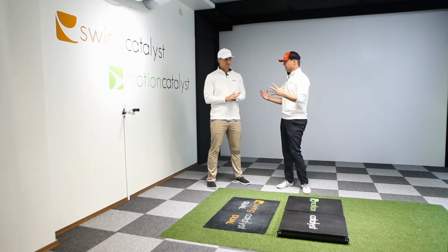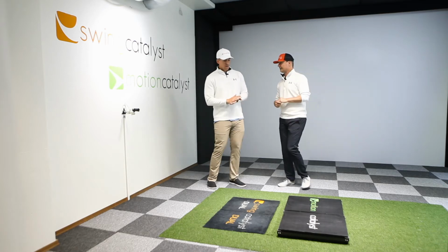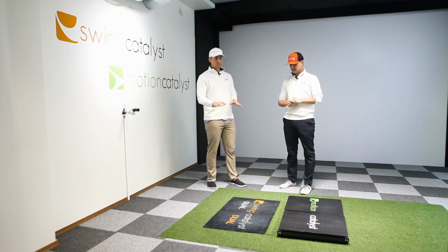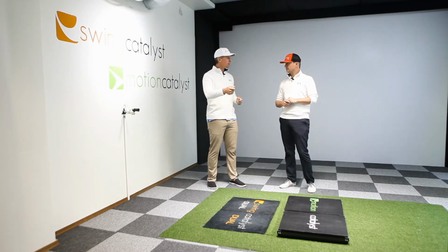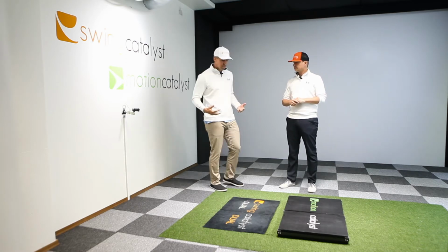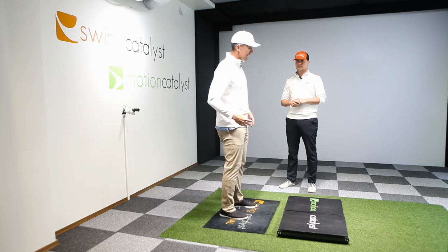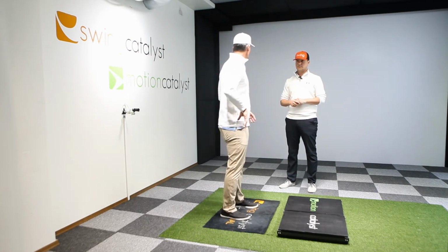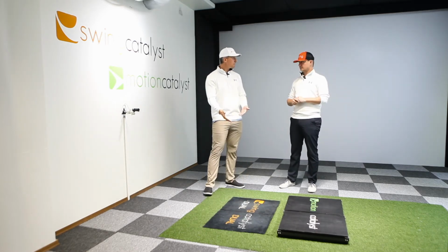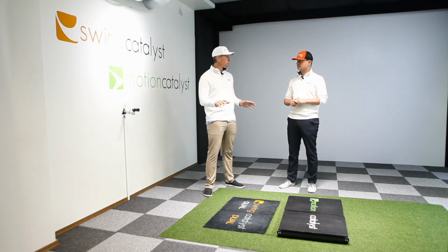But what are some things that our users should know about testing athletes, let's just say in a vertical jump, to make sure they're getting good data? Yeah, the biggest two things to know are that when you set your force plates down and turn them on, they're measuring at 0. Second one is, if I'm going to run a test on myself, when I stand on the plates, I need to stand still, and I can't be wobbling from side to side, looking around, because all of these movements will create vertical forces that the plates will pick up. And if my body weight is incorrect, all of the calculations from the force plates will be off.